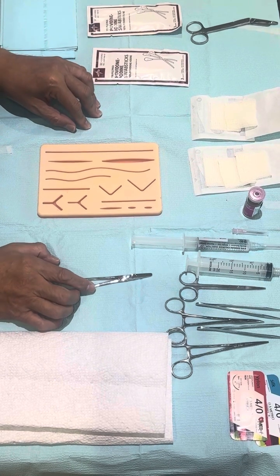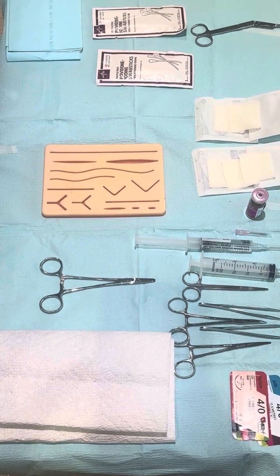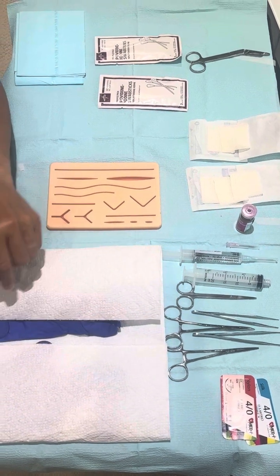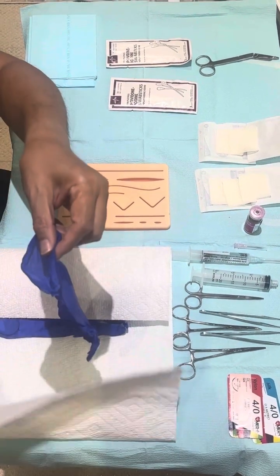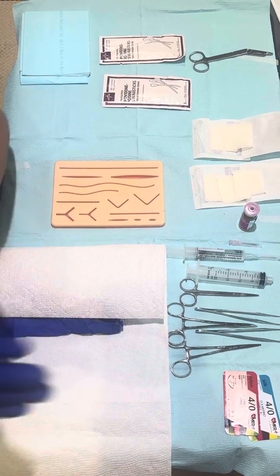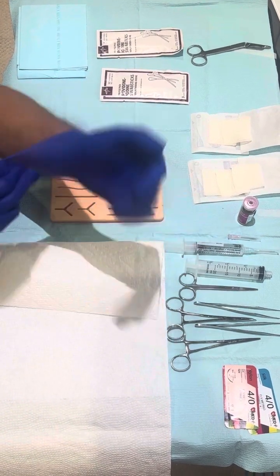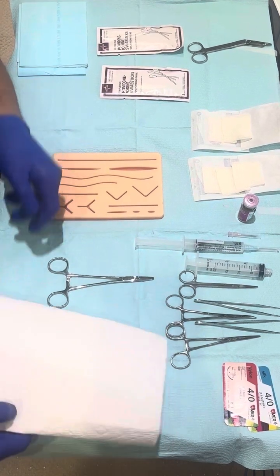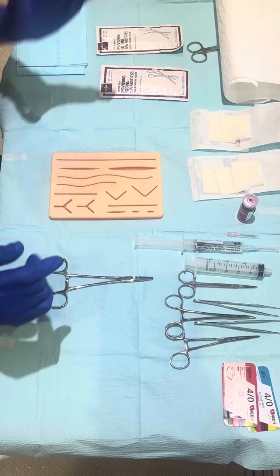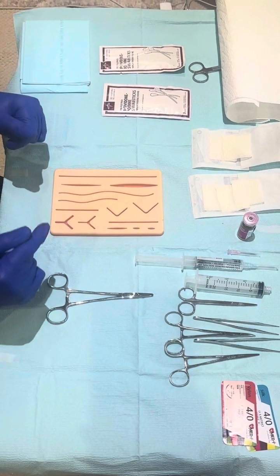Here I will demonstrate first how to clean the wound. Assuming that the area is a sterile area, I will now use my gloves. Assuming these are sterile gloves, I will start wearing my gloves. Assume the other half of your table will be the dirty area. After this, you have to clean the wound.